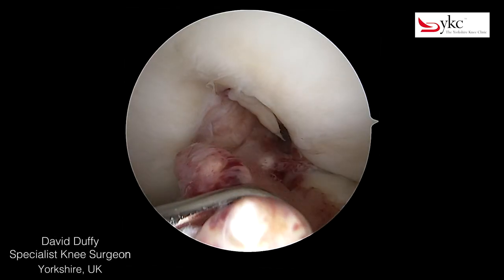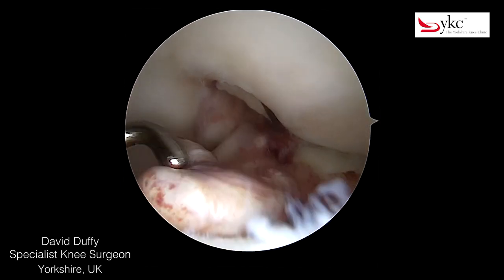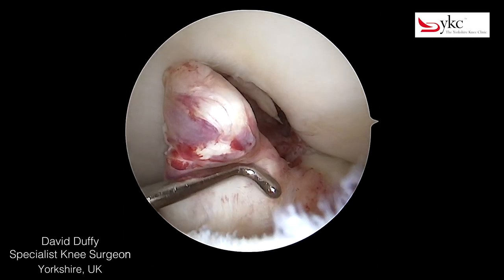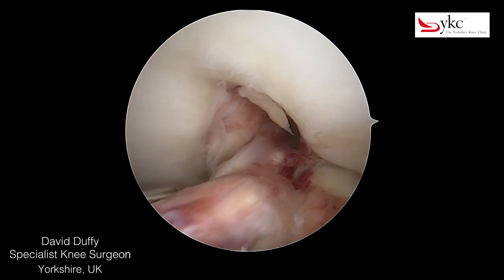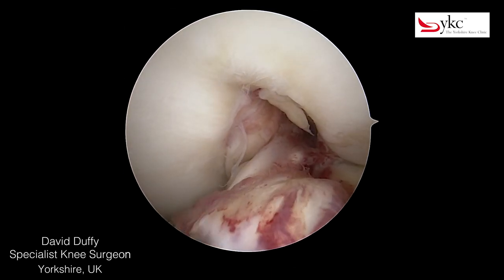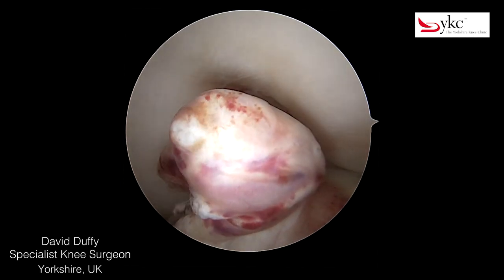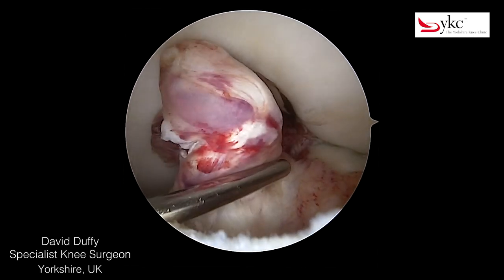Inside the knee, I am examining an acutely ruptured ligament. It is retracted after tearing away from its femoral attachment and has now formed a mobile stump, sometimes referred to as a cyclops lesion. This can get caught between the femur and tibia and block the knee going fully straight.